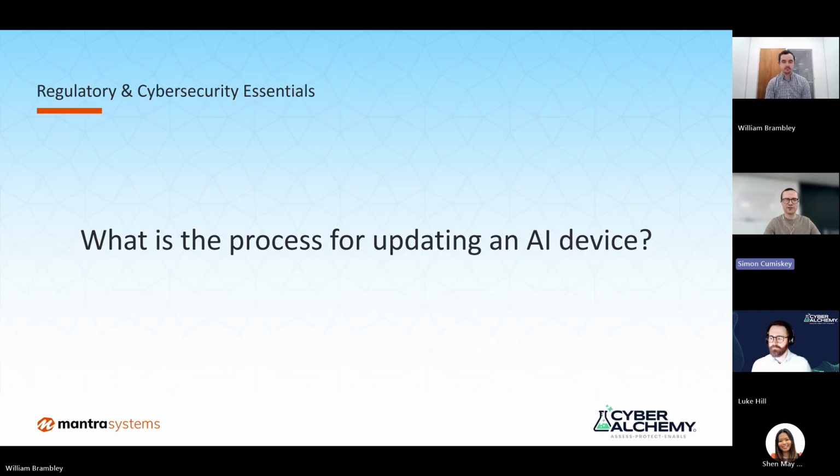Yeah, there's a bit of crossover between this question and the last question, whether you're intentionally updating your self-hosted model or whether your external API model is being updated. There needs to be some way that you can ensure that as those changes are made, the performance of the device isn't degrading. It ties in to what I was talking about earlier, having some sort of training set that you can benchmark against. If you know that your model performs with an accuracy of 85% when classifying into binary outcomes with this test set, and then you update your model with additional training data, or your external API model is updated, you can rerun that benchmark testing to ensure that the performance is still there.